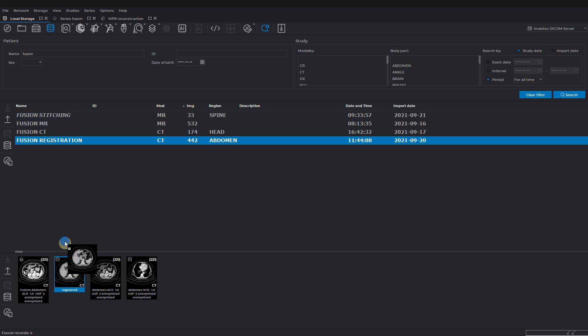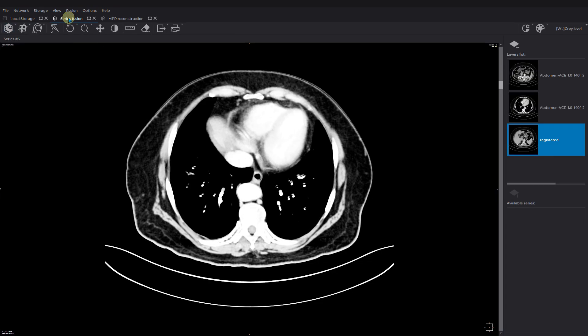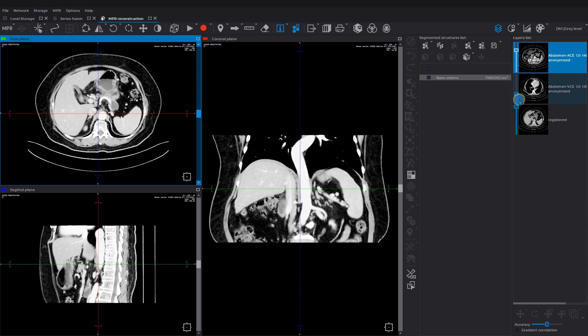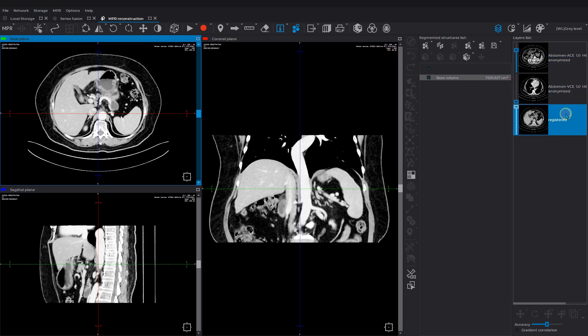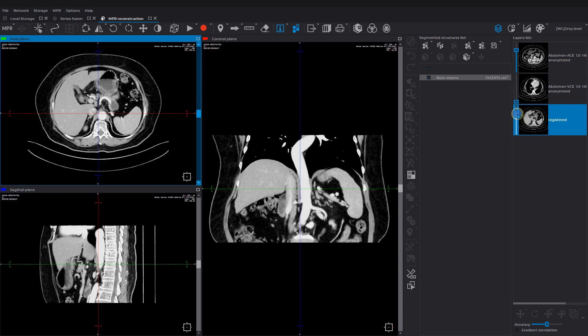As a comparison, let's check out the registered series by pulling it to the series fusion tab and open the MPR. We are taking down the visibility of the second layer to match the upper layer with the non-rigid registration. Now we can see that the organs are matching.